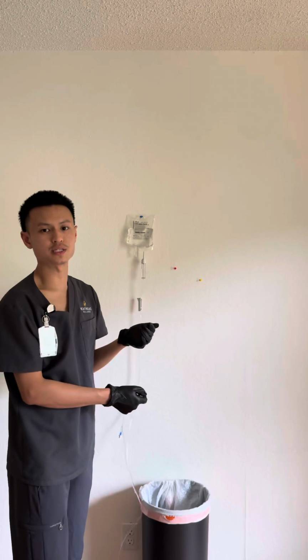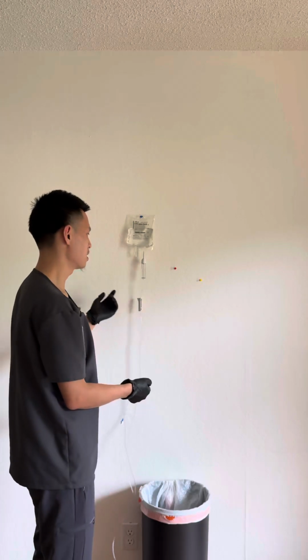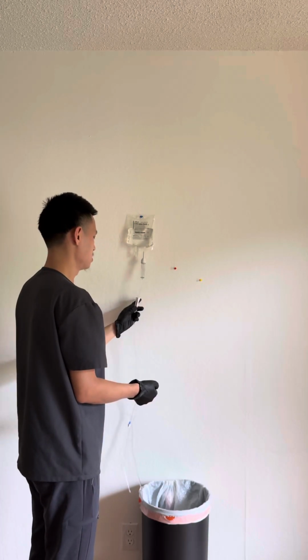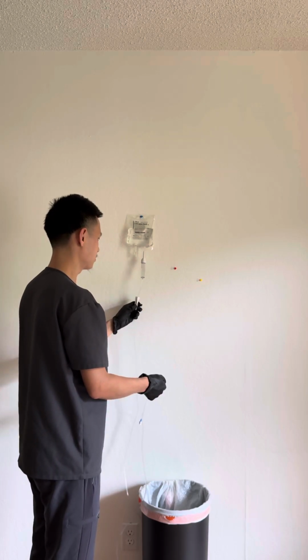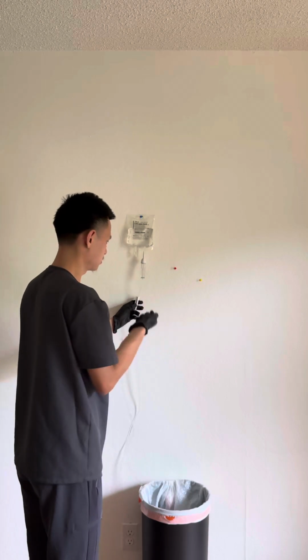In this case, for the fluid, it is going to be 38 drips per minute, and I will count that for 1 full minute. I am going to slowly roll the clamp and count the drips going into the chamber, and it should be 38.